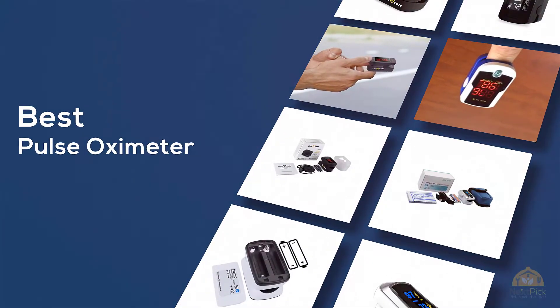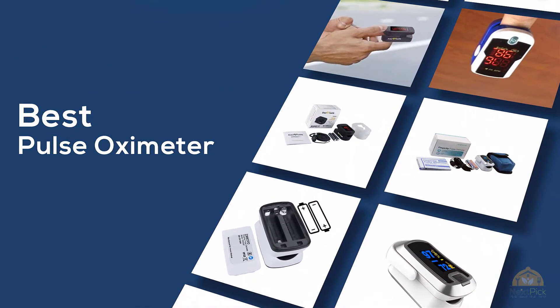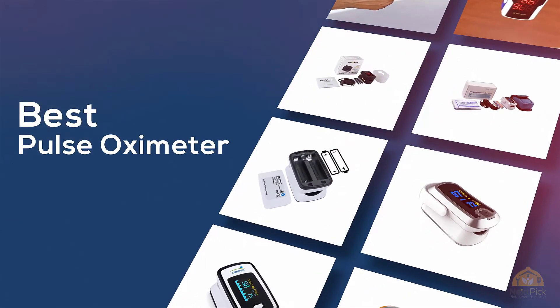If you're looking for the best pulse oximeter, here's a collection that you've got to see! Let's get started! At any time, you can click the circle for more info and real-time deals.